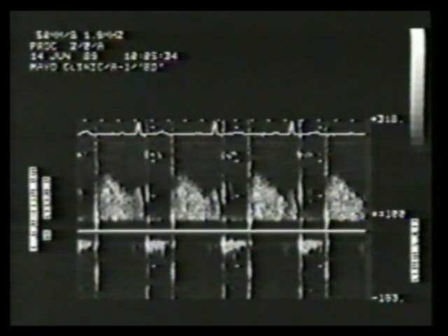In addition, since PA diastolic pressure is relatively close to RV diastolic pressure, the effect of atrial systole is often evident on the PR velocity spectrum. Observe the late diastolic notching, which follows the P wave on the ECG.